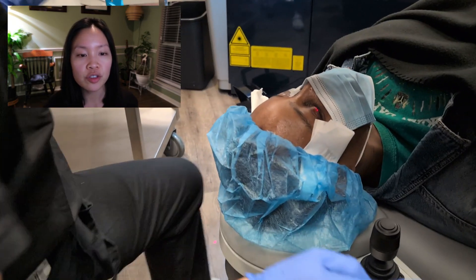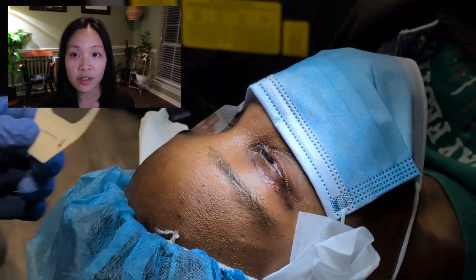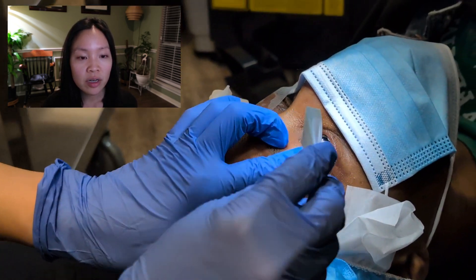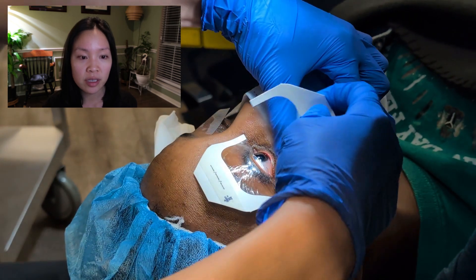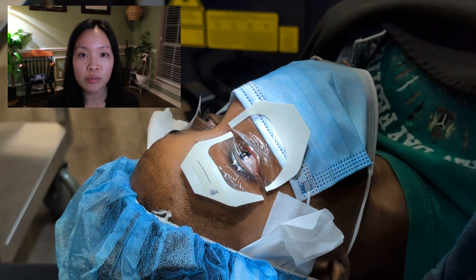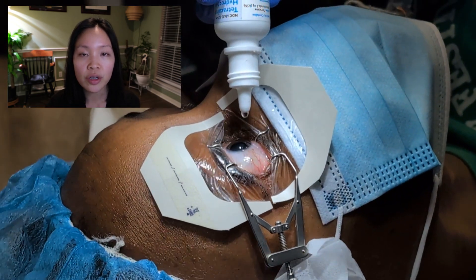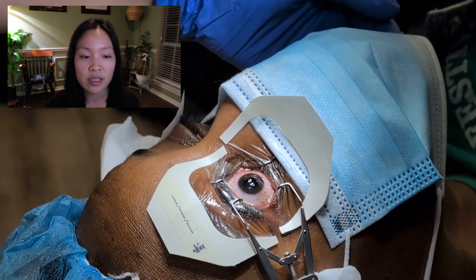I'm going to be watching this surgical video with you and commenting on what's going on. We're going to do the right eye first and then the left eye follows afterward. This patient is lying down on our surgical bed. We are here in our refractive laser suite and the first thing we do is apply Tegaderm patches to cover and protect the upper and lower eyelids and eyelashes. It's very natural for patients to try to squeeze their eyes or blink during the procedure, and protecting those lids and lashes is so important because when you blink you squeeze out oily secretions from your meibomian glands which can dirty the surgical field and affect the outcome.